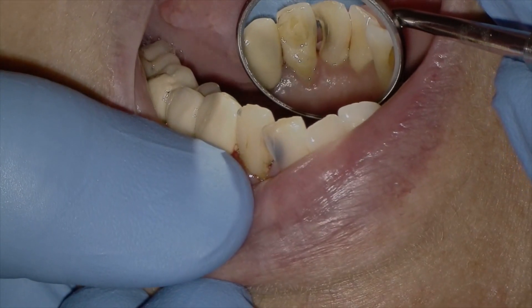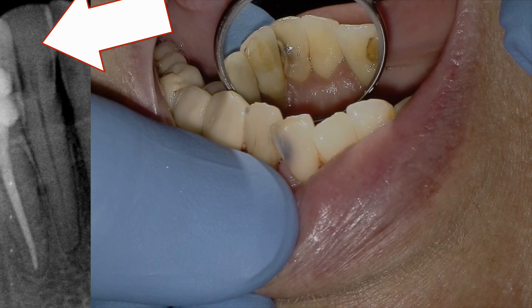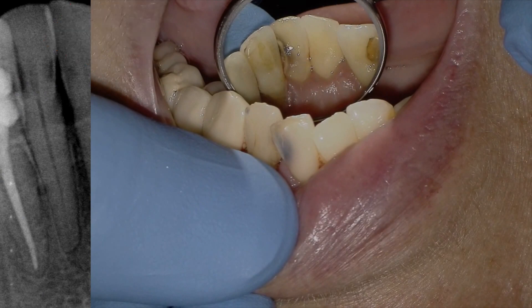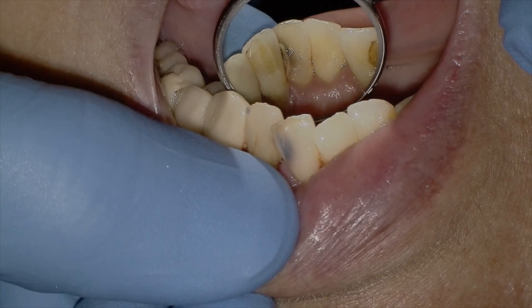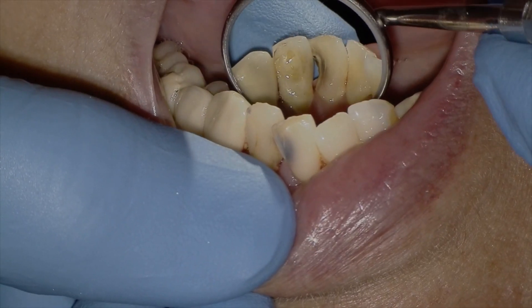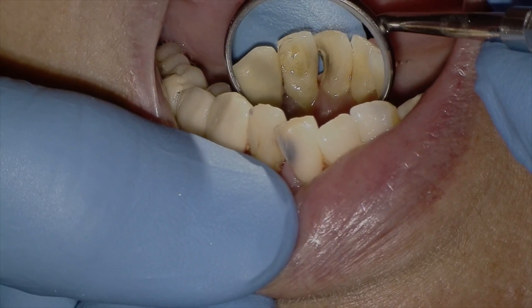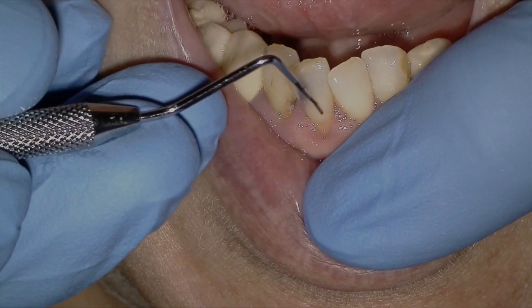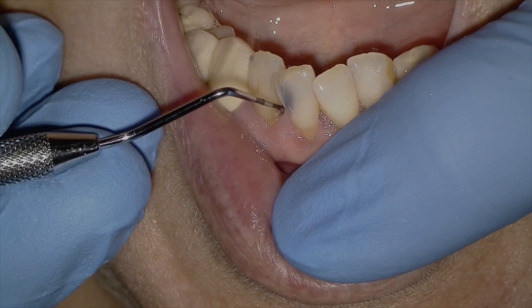We have a huge caries lesion on tooth number 42. To your left you can see the radiograph and the caries. The mandibular right central incisor has decay as well. You can see my glove right through this decay — it's amazing that this tooth is still vital, though it's inflamed.